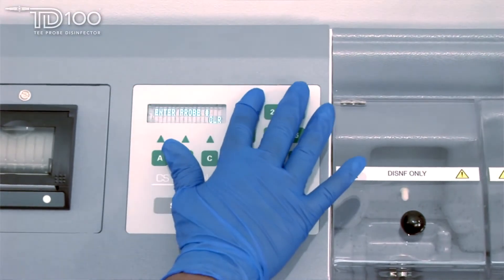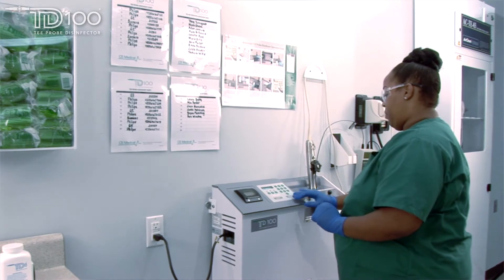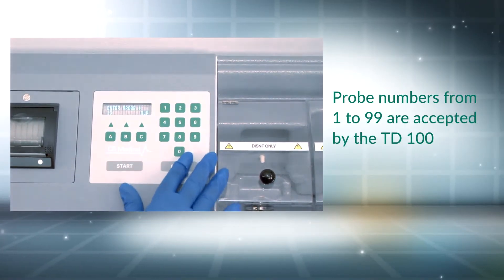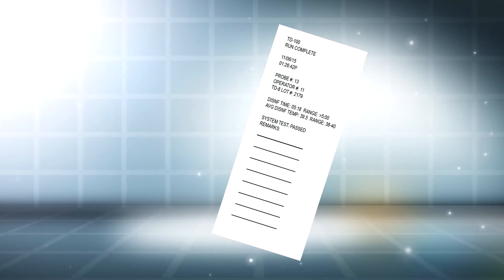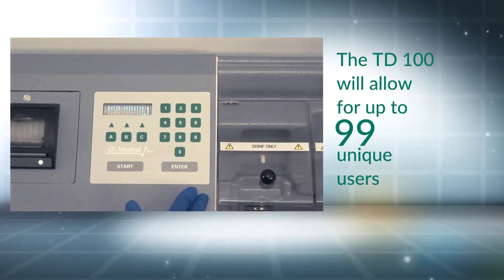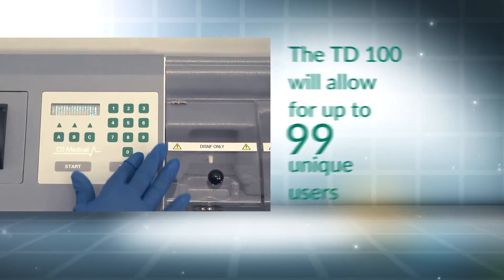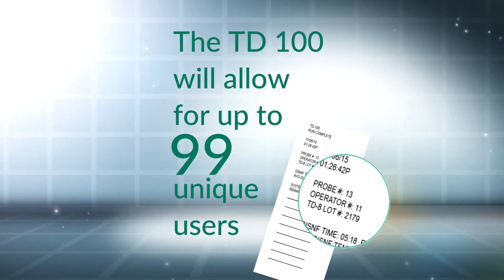At setup, the operator will enter the following information into the TD100 prior to the disinfection cycle. Many hospitals have more than one probe. CS Medical recommends that you label each probe with a number from 1 to 99. This number will be printed on the verification ticket at the completion of a successful disinfection cycle. A unique identification number should be assigned to each trained TD100 operator, and like the probe number, it will be printed on the verification ticket.